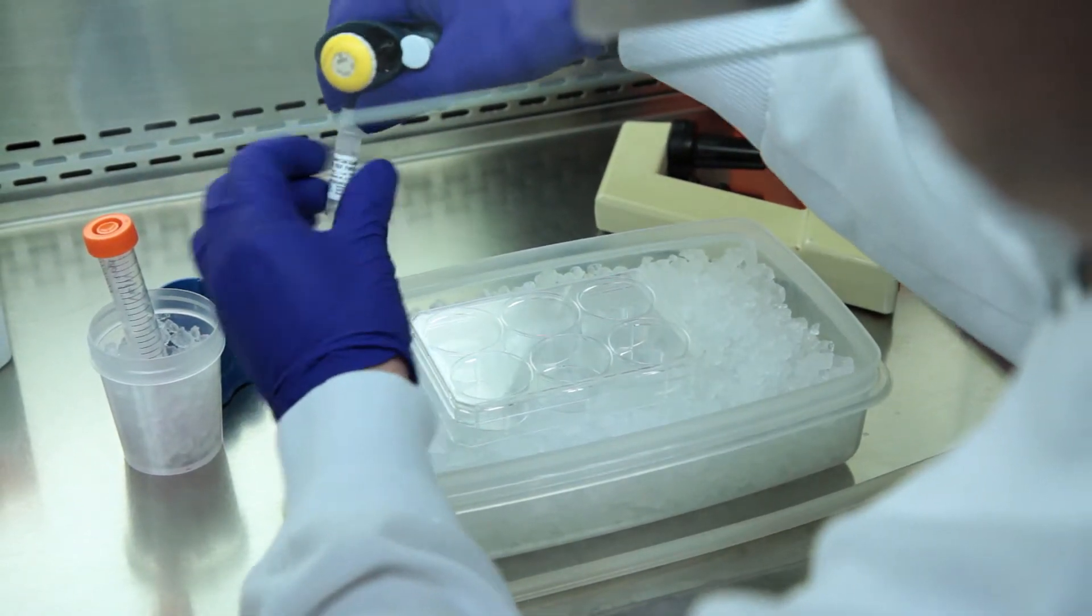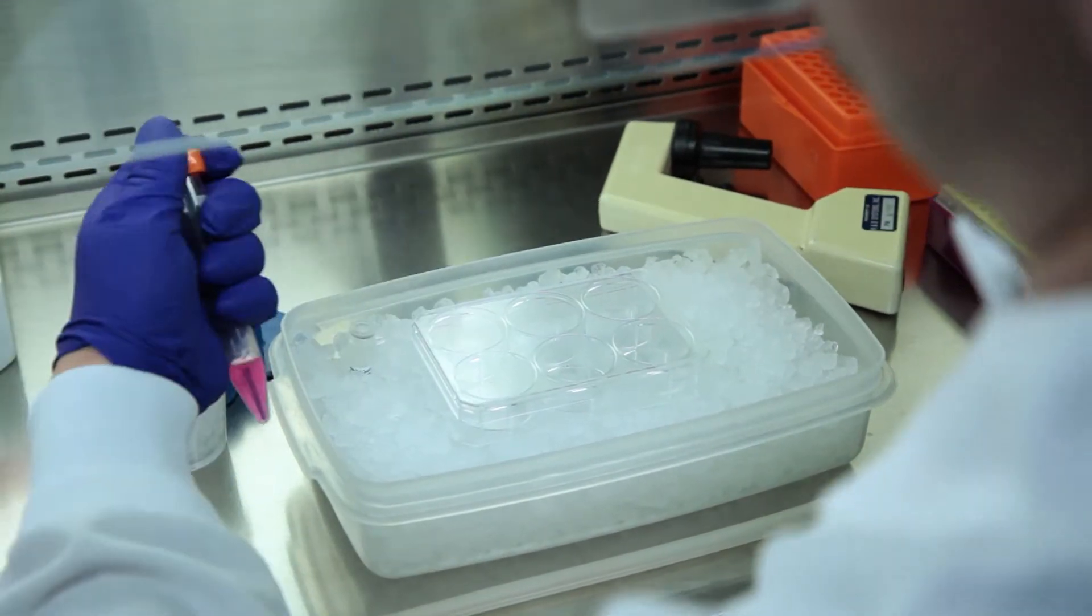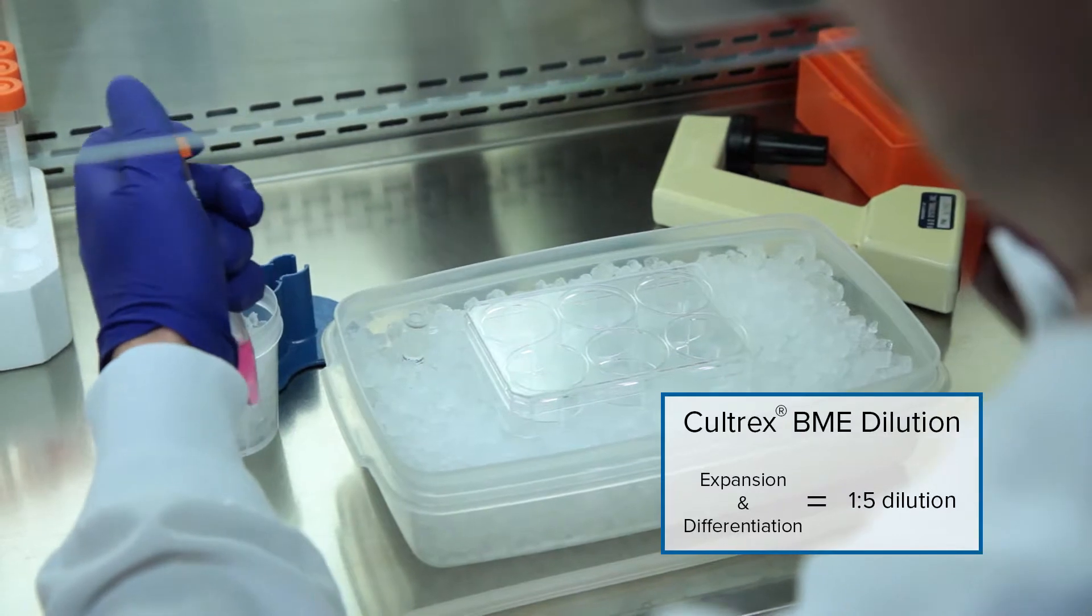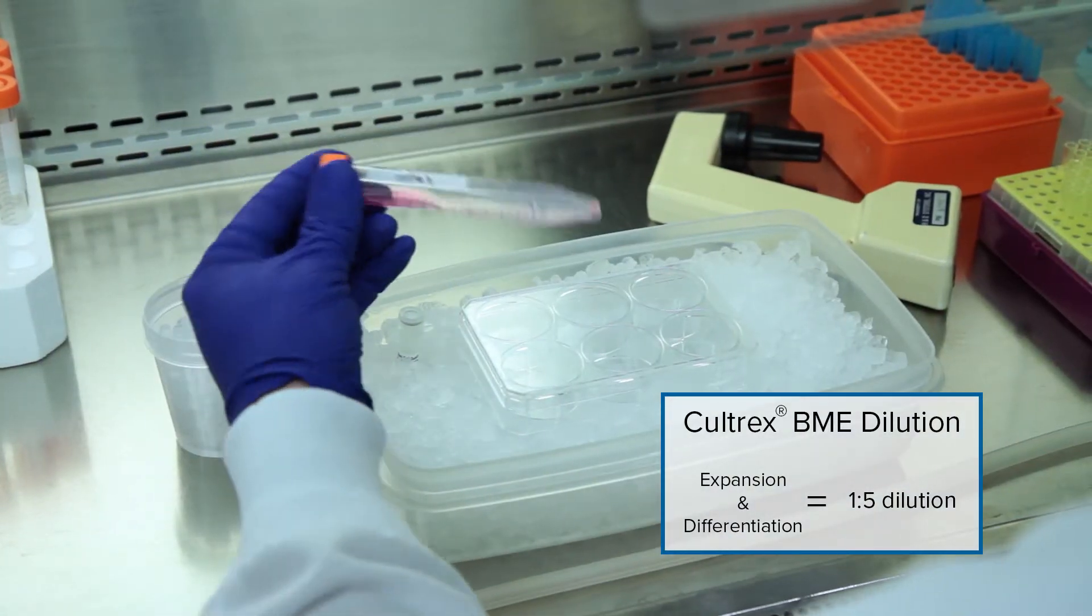When preparing Coltrex BME for stem cell expansion and for stem cell differentiation with transwell inserts, dilute the Coltrex BME 1 to 5 in cold DMEM F12 media.